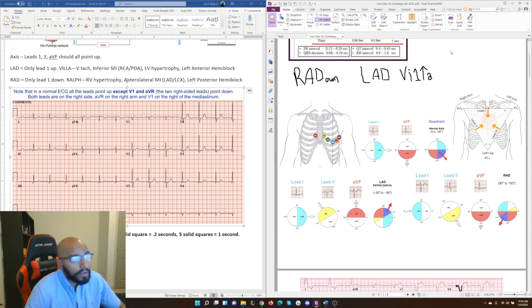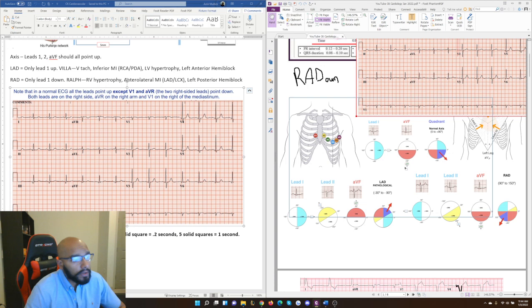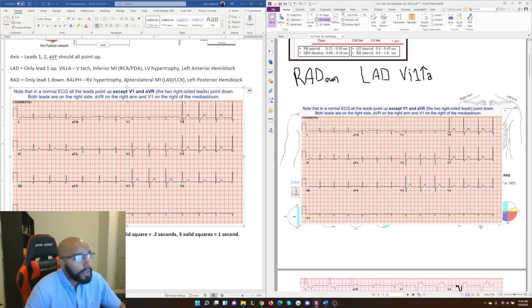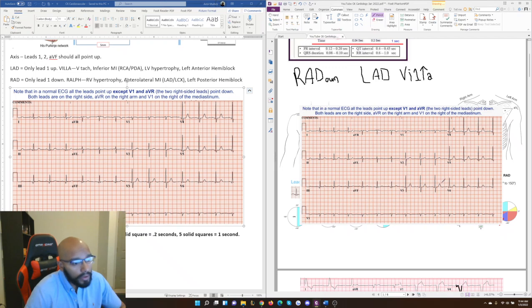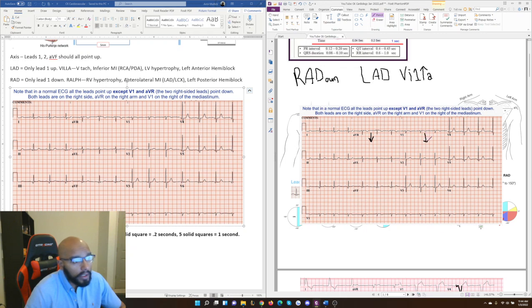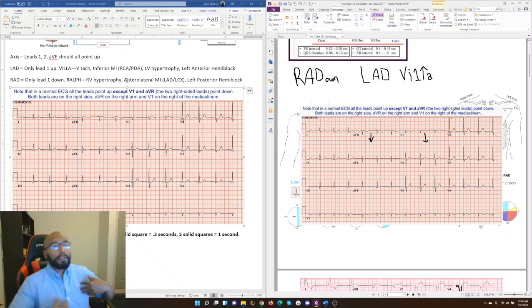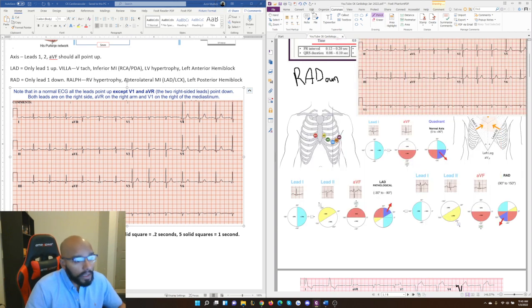Looking at this 12-lead ECG, you can see that every lead — lead 1, lead 2, lead 3, AVF, AVL, V2, V3, V4, V5, V6 — all point up, except AVR and V1 which point down. In a normal ECG, all leads point up except V1 and AVR, which are the two right-sided leads. AVR is on the right arm and V1 is on the right of the mediastinum.